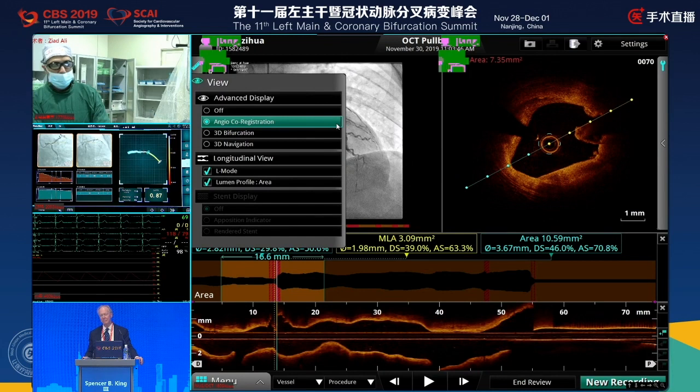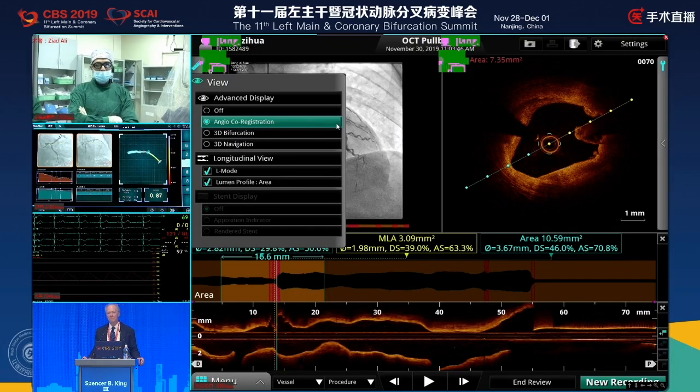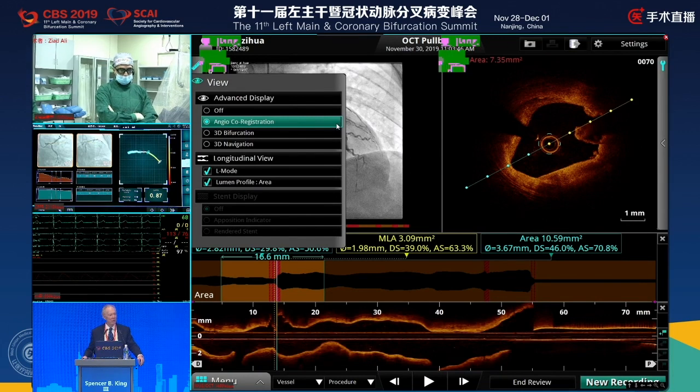So we have a patient who had 8 hours of chest pain. The only lesion is the septal, the FFR negative LAD, FFR negative ramus. So is that troponin leak or not? No, to be clear, there was no troponin leak. Okay, so we didn't know that till now. So with 8 hours of chest pain, we have no idea what it is.